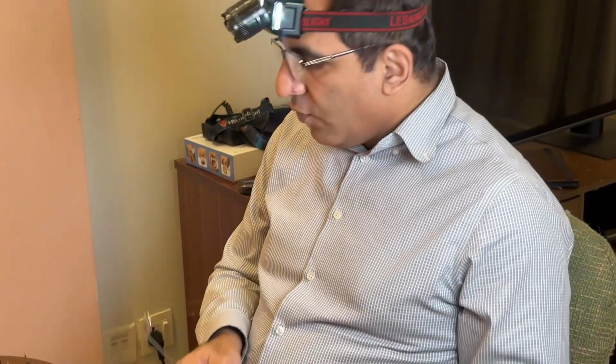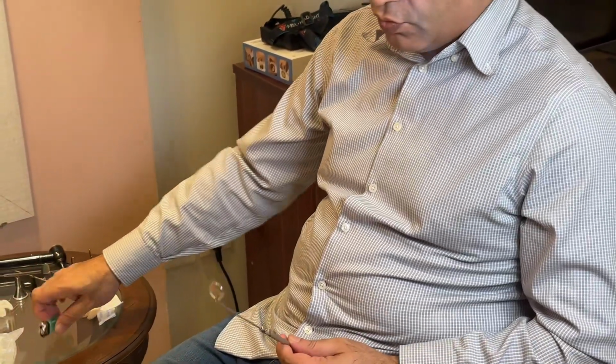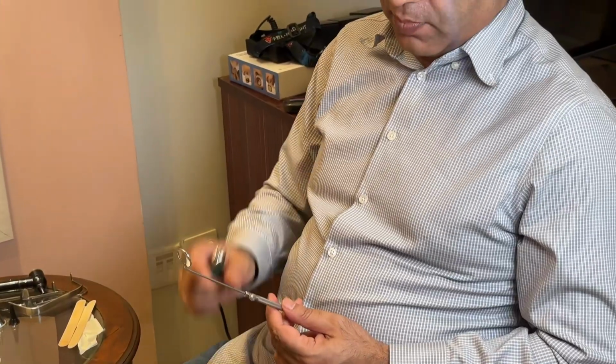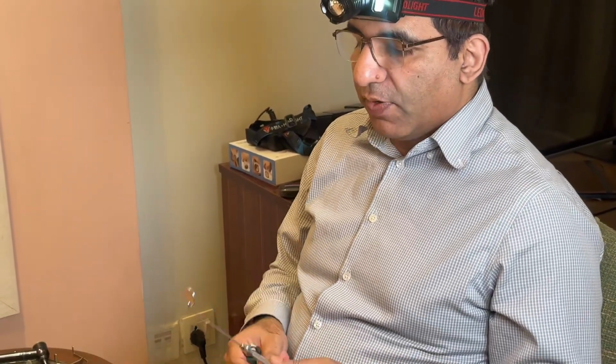Okay. For indirect laryngoscopy, we need a gauze piece, and again we have to heat the mirror end to prevent the fog from coming on the mirror. So now I will explain the procedure to the patient and then we will perform it.